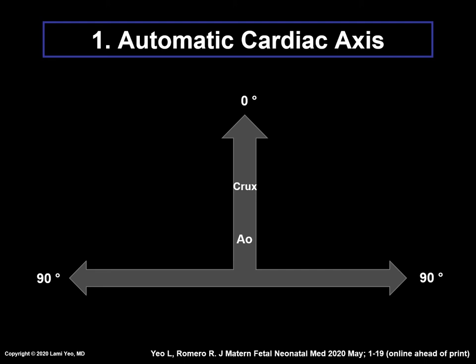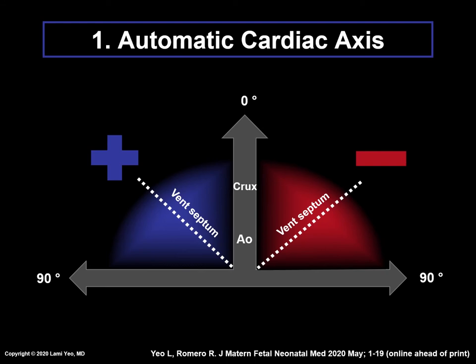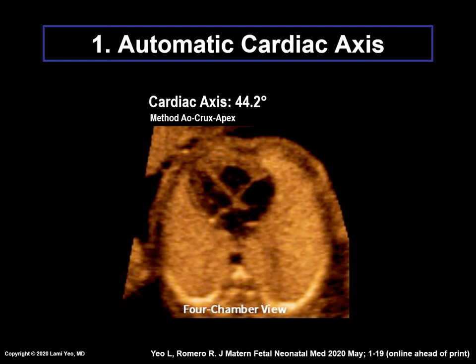If the ventricular septum is located to the left of the line drawn internally between the crux and cross-section of the aorta, the cardiac axis angle will be positive. However, if the ventricular septum is located to the right of this line, the cardiac axis angle will be negative. In summary, after the marking of seven anatomical structures is completed and the nine diagnostic planes are generated, FINE will depict the cardiac axis automatically in the four-chamber view diagnostic plane. In this example, the axis is 44 degrees.